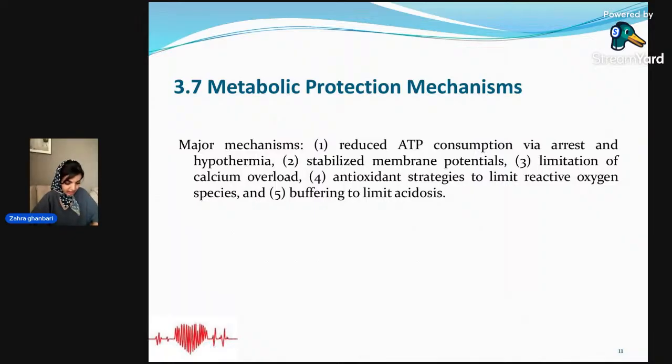Yes, the types of myocardial injury we must prevent. One of them is ischemic injury, because of lack of oxygen and nutrients during cross clamp. To prevent this injury, we use a high concentration of potassium in our solution. We reduce the temperature of the heart to reduce the metabolism of the heart cells.